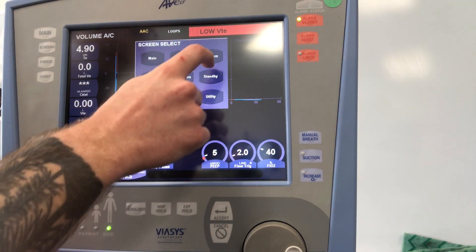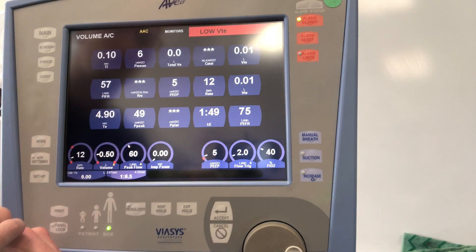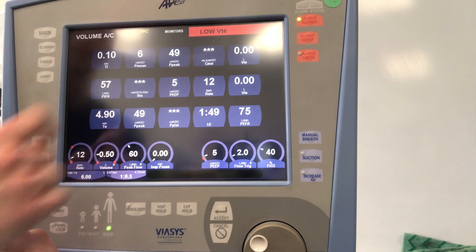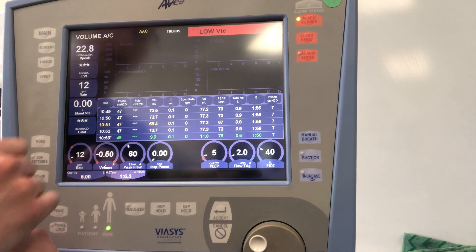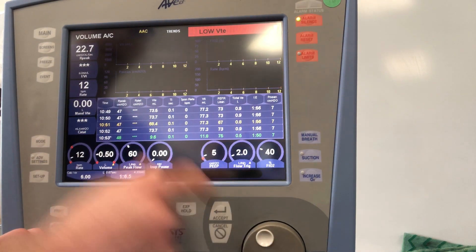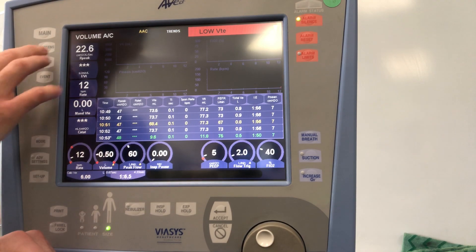If you don't want to watch a waveform and want numbers for quick vent checks, hit Monitors. You'll have all of these values — these are just the defaults for volume AC. You can tap and scroll through to accept different values. Under Trends, you can go back and view your trends over time. You can also change your waveform values and scales — X and Y axis — allowing you to trend patients on RSBIs or provide information to physicians.